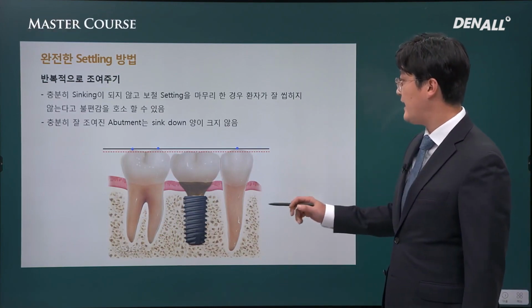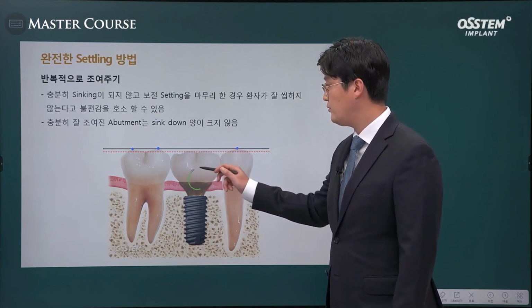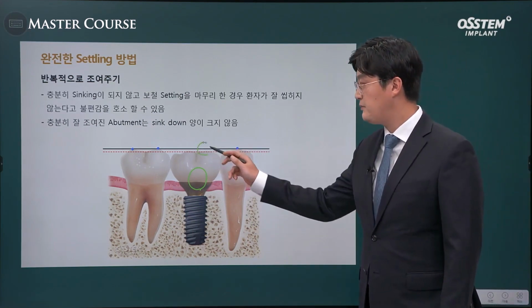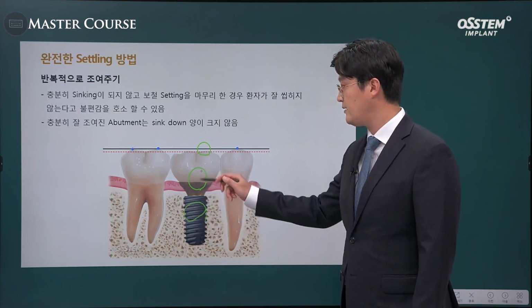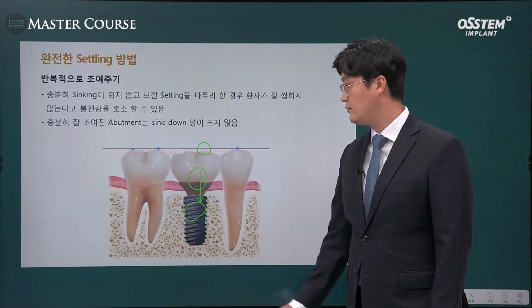If you do not do sinking down, if you do not do this several times after delivering final prosthesis, the patient may complain of inability to chew food. In the case of internal type implant, the sinking down cannot be avoided, therefore you need to tighten it repeatedly.